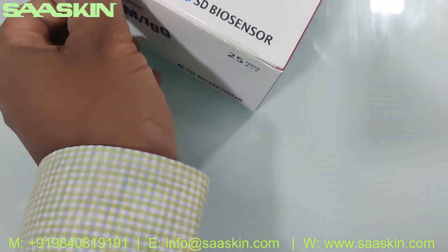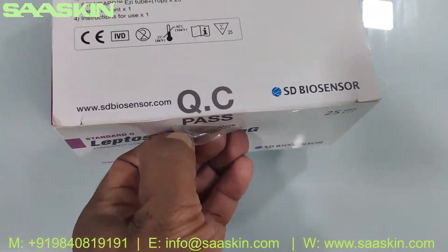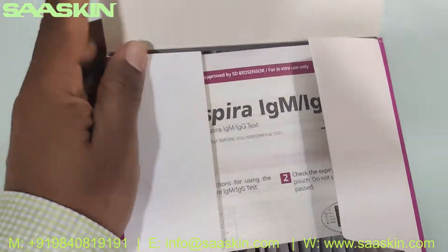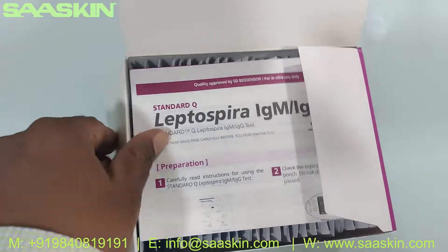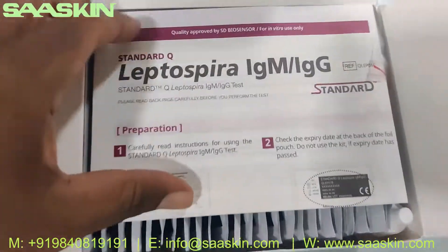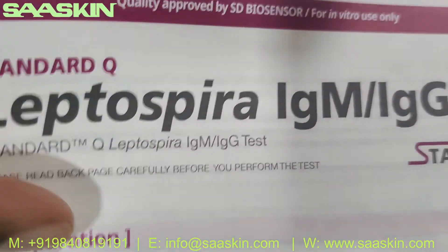You got a QC pass sticker here. You can see inside the box — you get this IFU brochure.